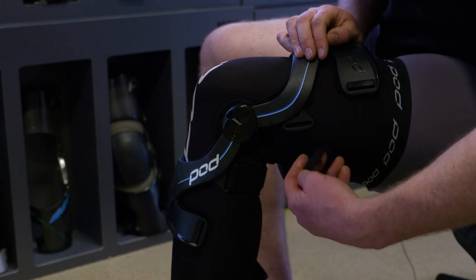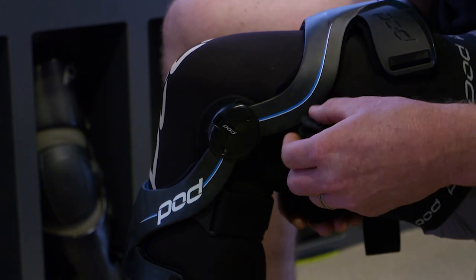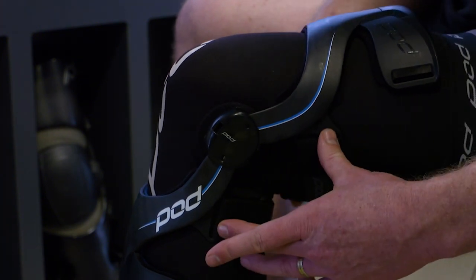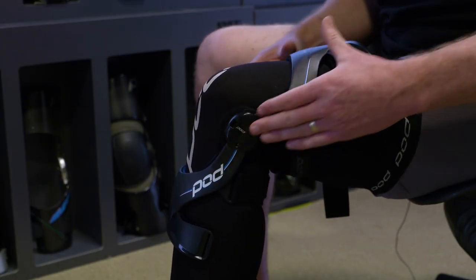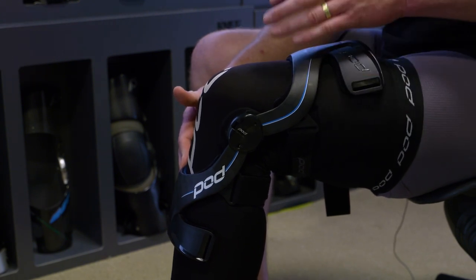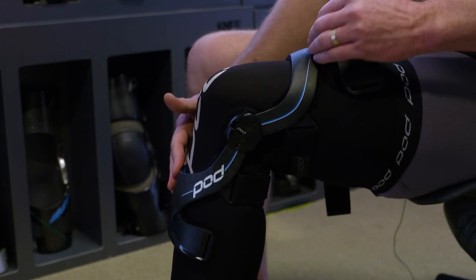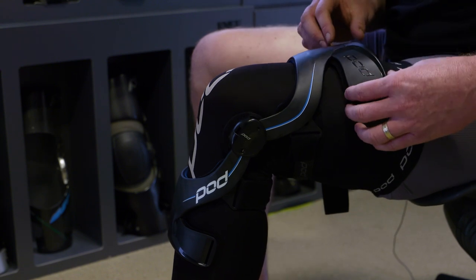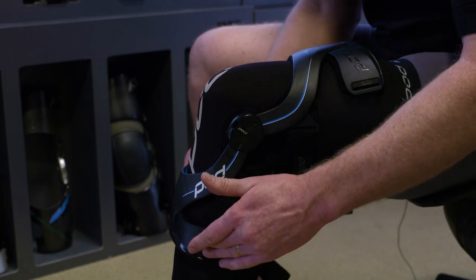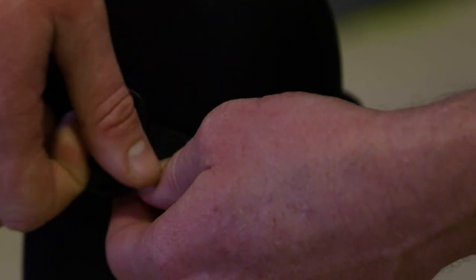The next most important is strap number two, which anchors the upper frame. Straps one and two both have strap pads because they need to be done up tight. Over the 10 years Pod has been producing industry-leading action sports braces, we've evolved to adaptive cuffs. Connected to the upper and lower frames are these adaptive softer cuffs. Straps three and four are what you do up to secure and attach those cuffs to your body.